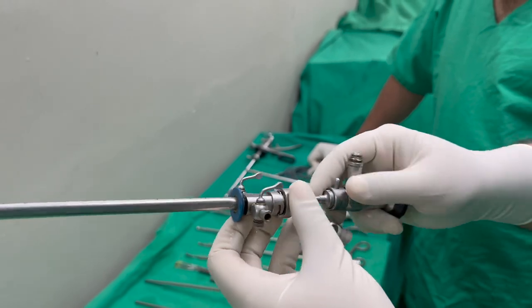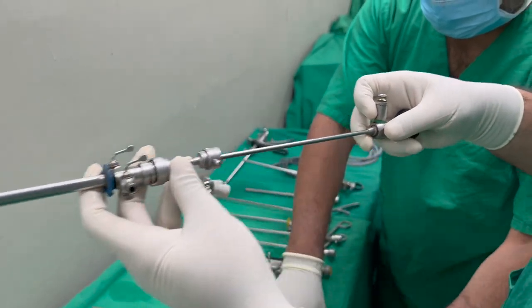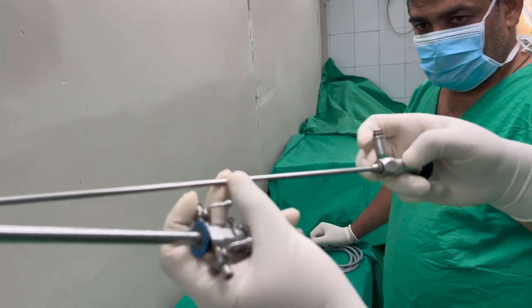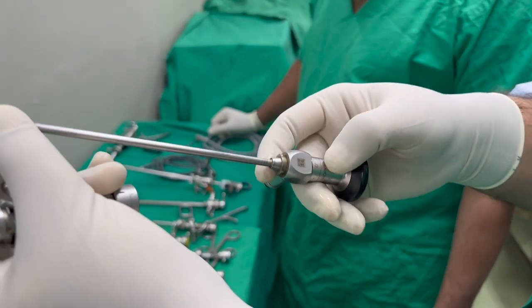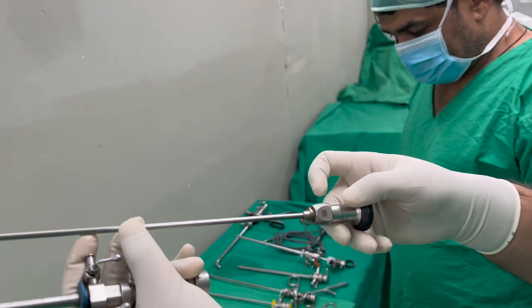Previously we saw that telescope — the telescope is placed here. We can take out the telescope and then see that this is a straight telescope. The 30-degree we saw was going down. This is a straight telescope and you can see it — 0 is written over here. Straight means 0. That other one was looking down at 30 degrees. 30 was yellow and 0 is green.